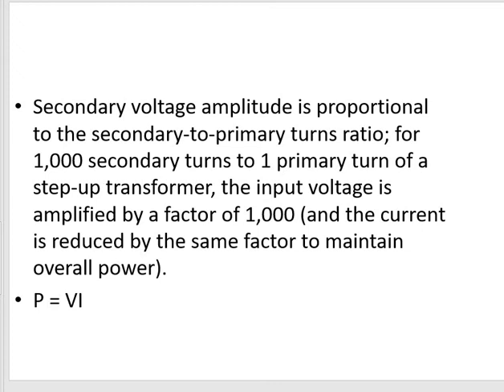The voltage applied is 240 volts. If the primary is 200 and the secondary is 1000, the voltage at the secondary is multiplied by 5.